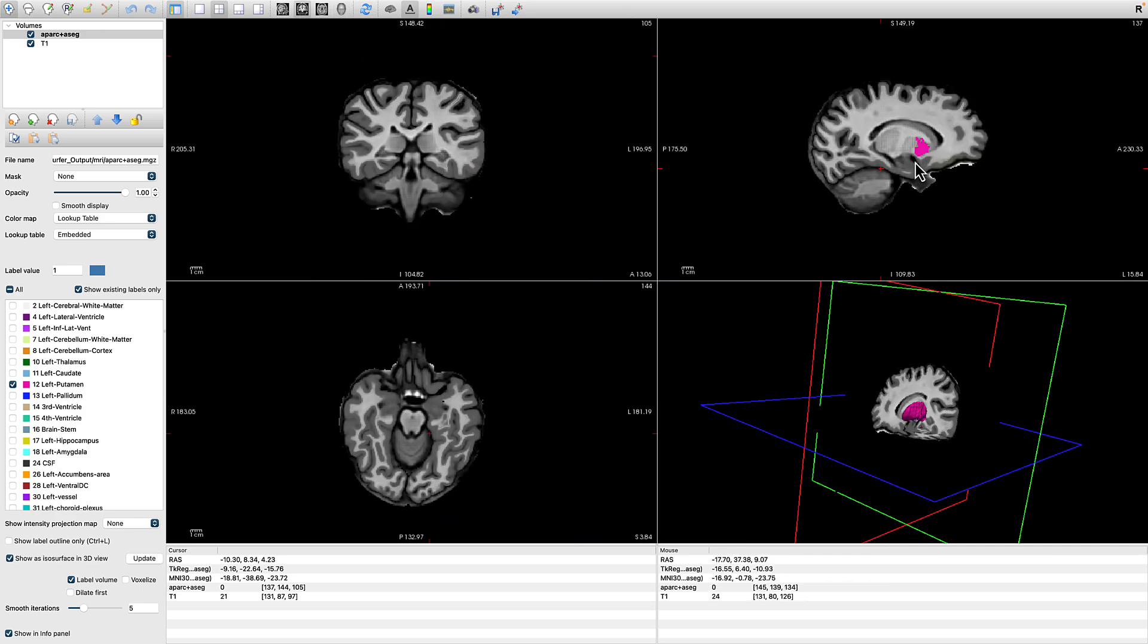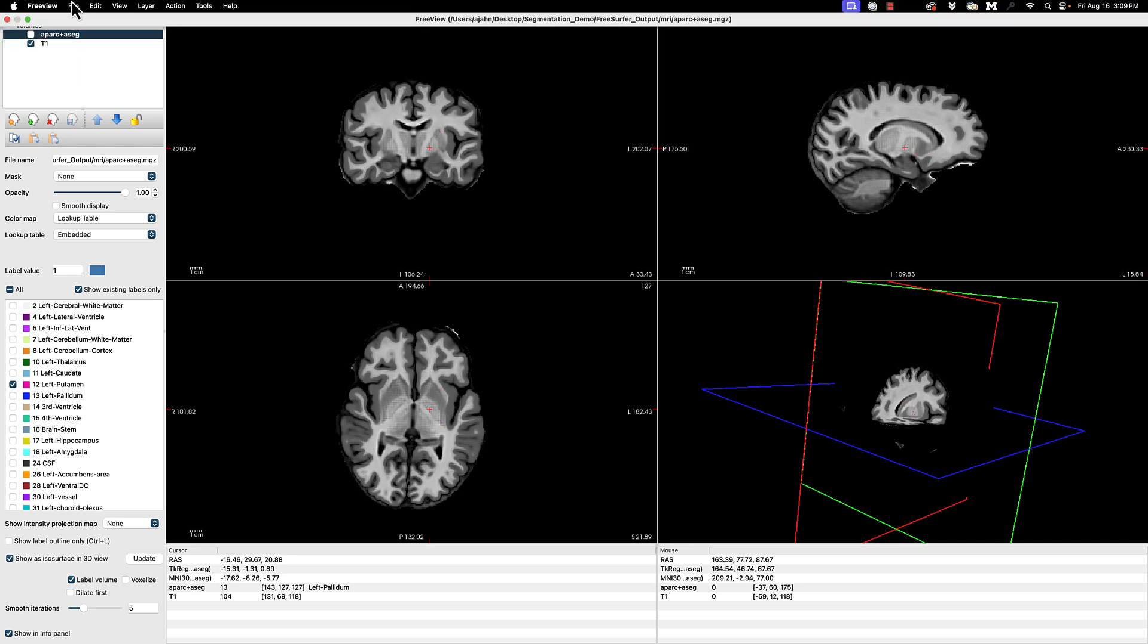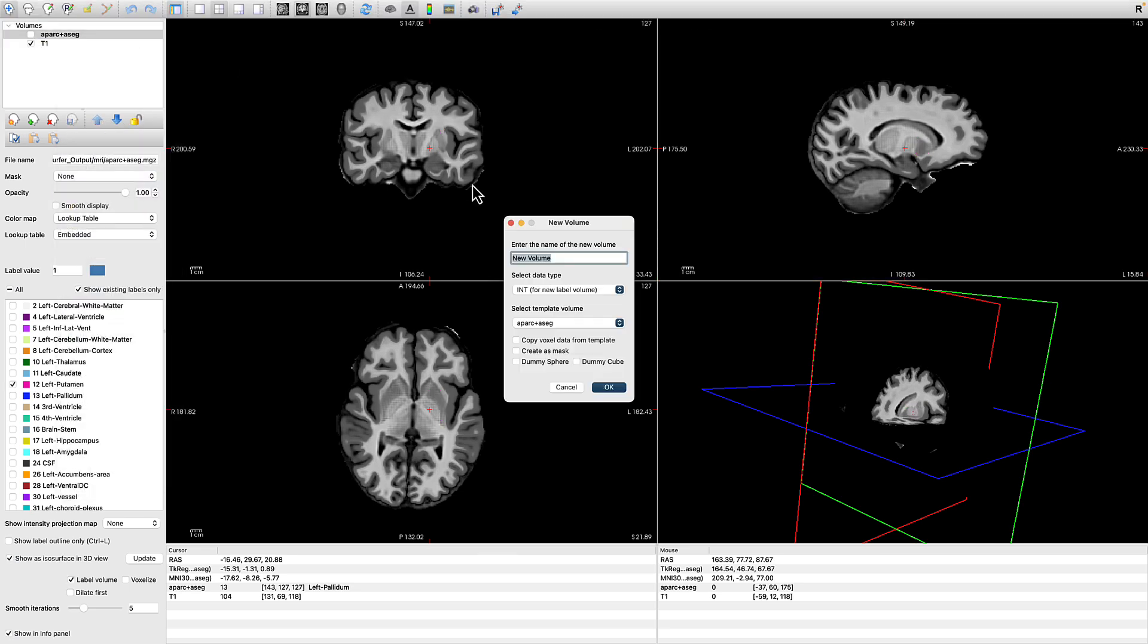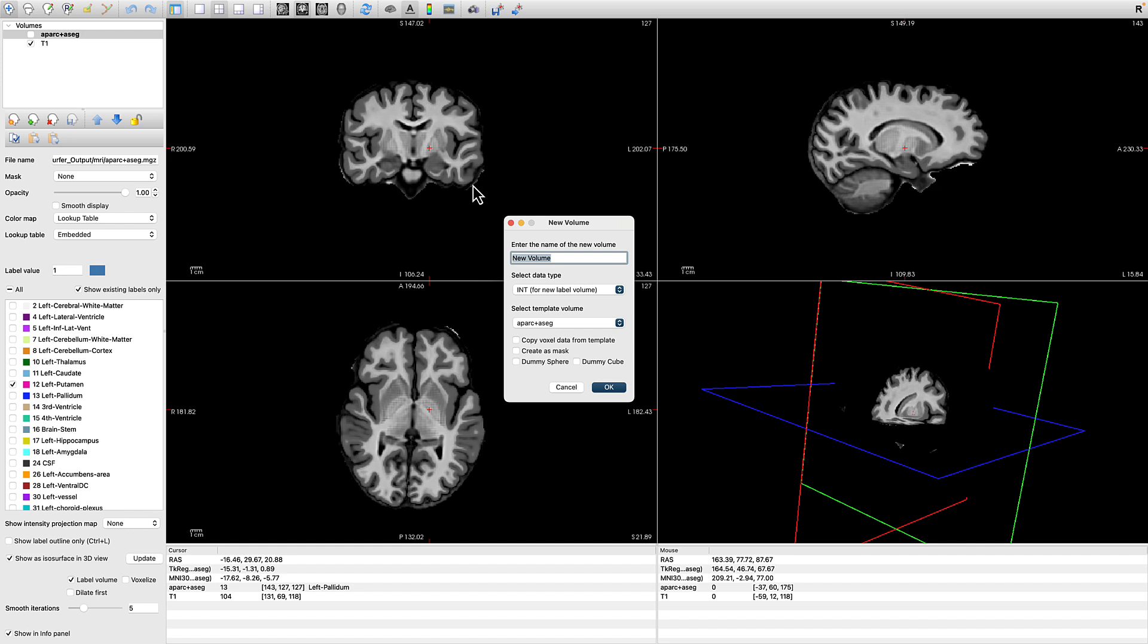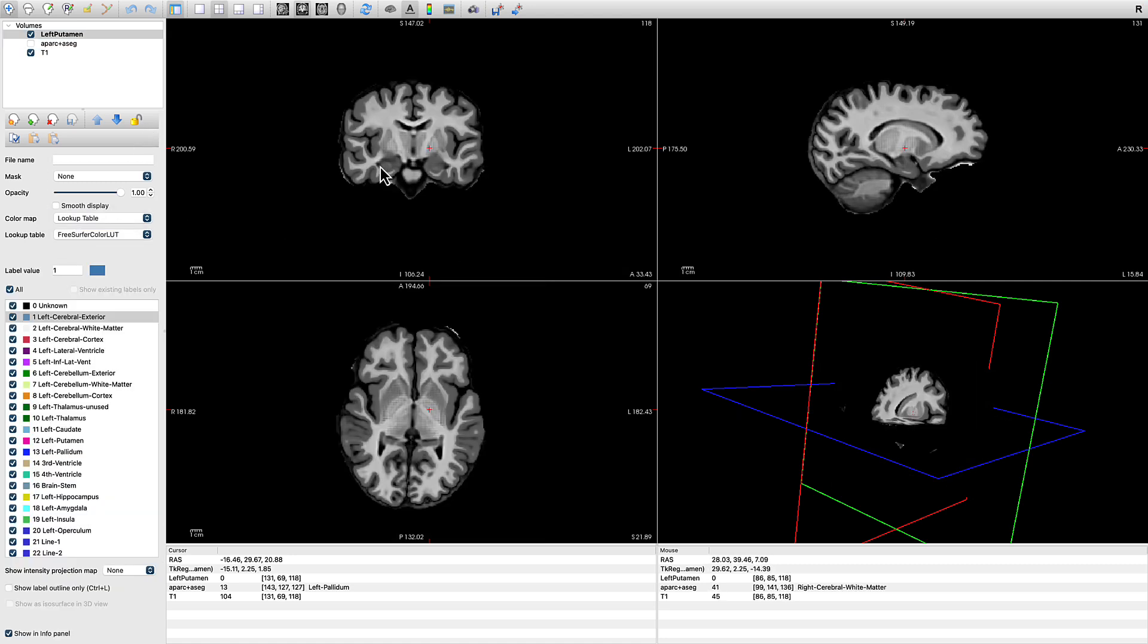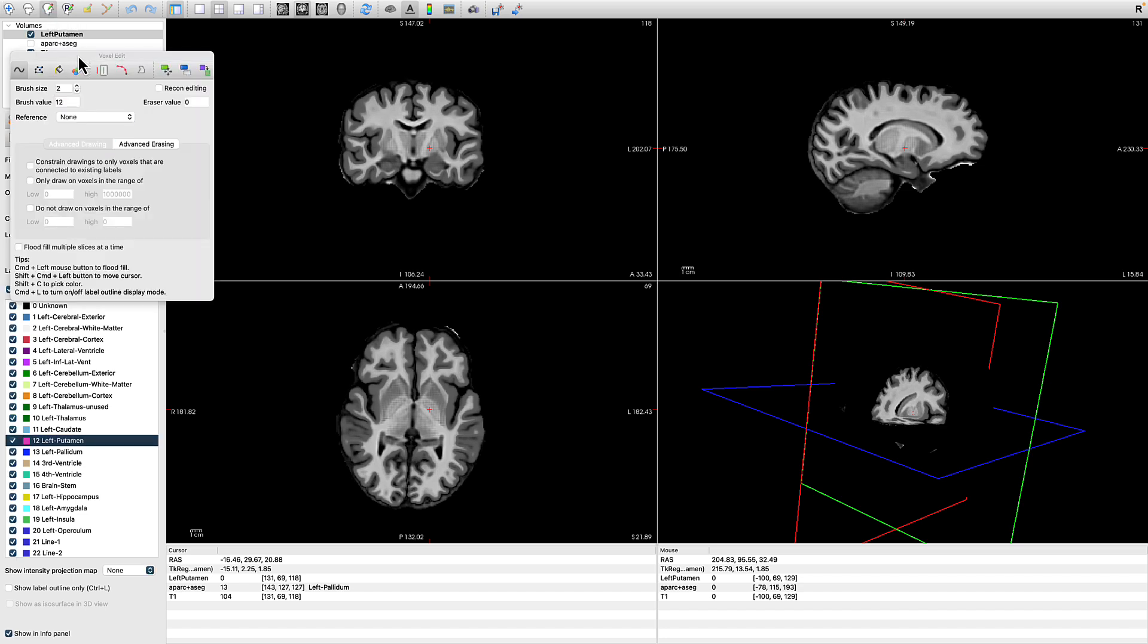Let's go back to our three orthogonal views. Uncheck the box next to aparc plus aseg to hide it. Go to File, New Volume, and let's call this Left Putamen. The template volume is going to be T1 to make it have the same dimensions as the anatomical image. Change the lookup table to FreeSurfer Color Lookup Table, which gives you the benefit of being able to highlight any of those options in that window in the lower left. When you do so, the brush value is automatically updated to reflect that value associated with that structure.